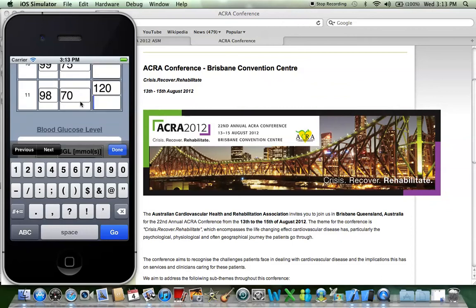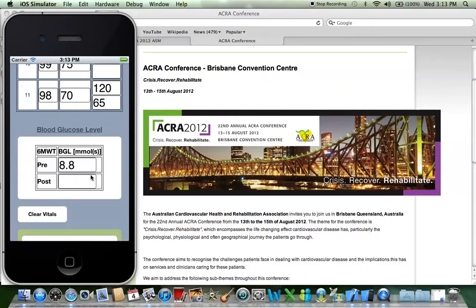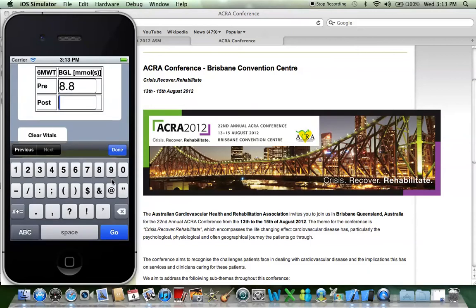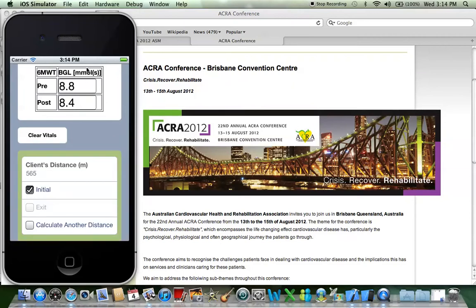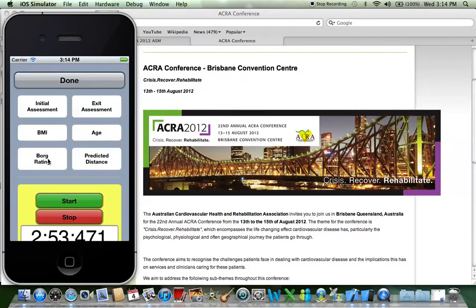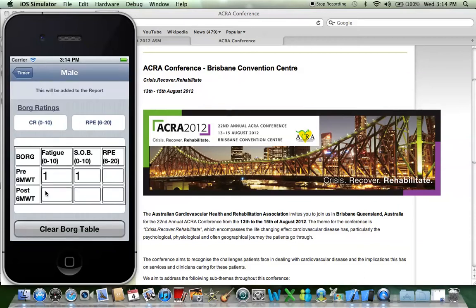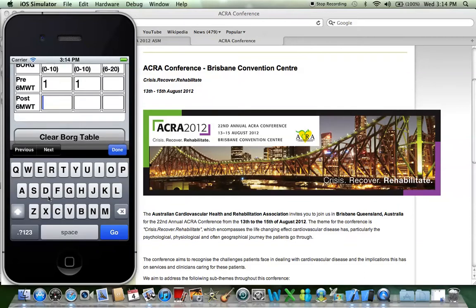We usually have a blood pressure here too, so let's say 120 over 65. And while we're down here, let's do a blood sugar — let's do 8.4. Now let's scroll back up — all our vitals have been filled in. We also need to do the Borg scale ratings: let's say it's a 3, a 3, and a 12.